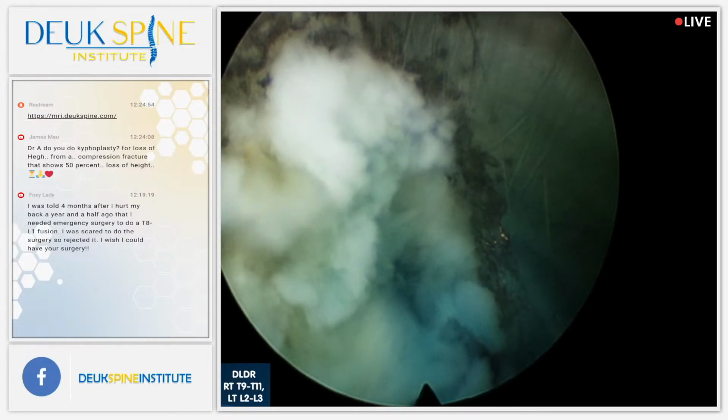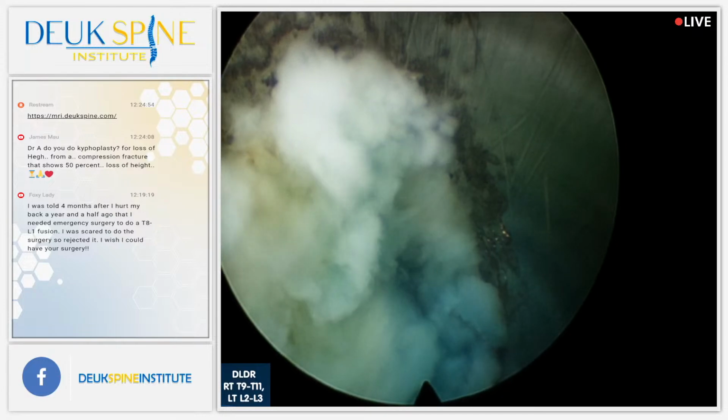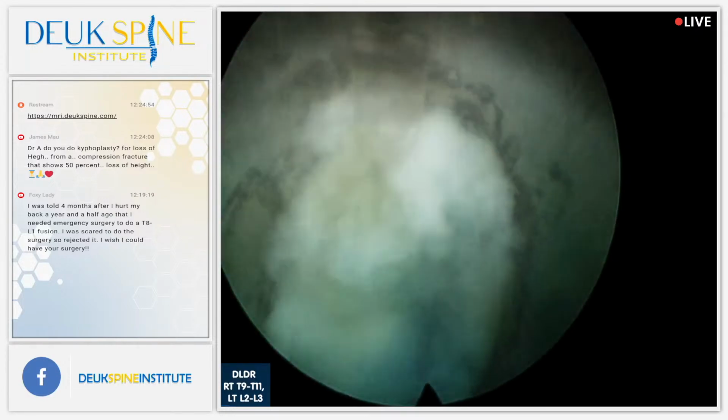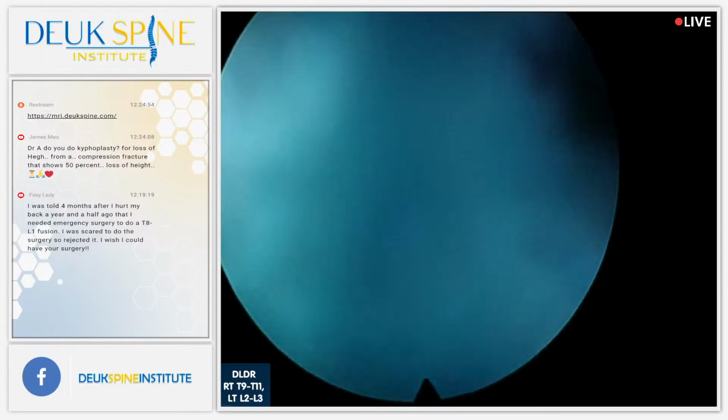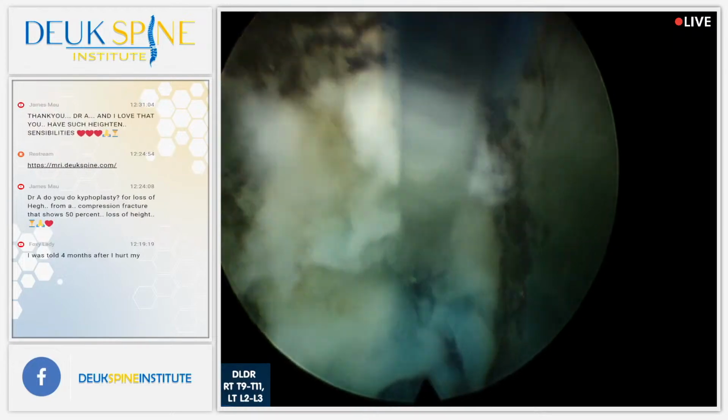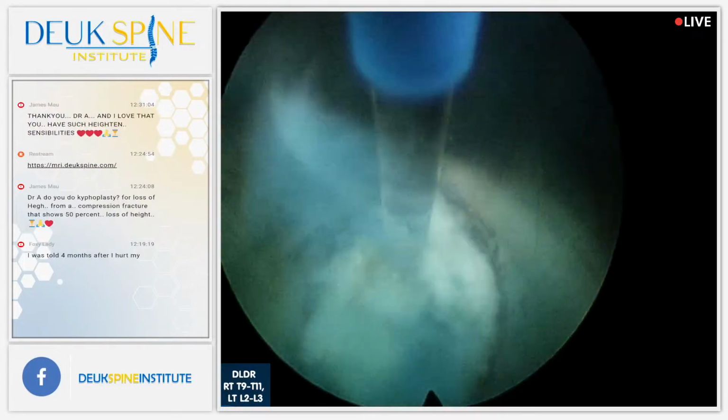All right, looking good. See the tear right there, the blue thing between the white? That is the annular tear. That's what led to the herniation. Remember, you can't have a herniation without an annular tear. That's always the first step.